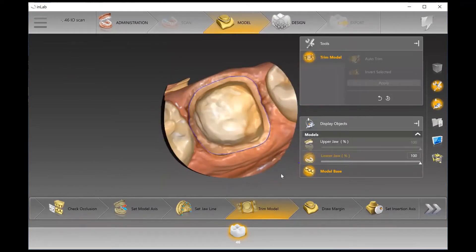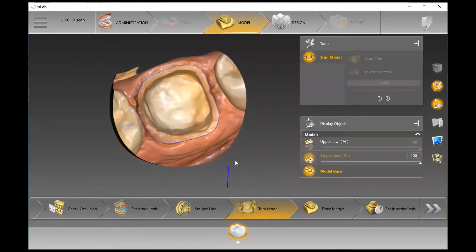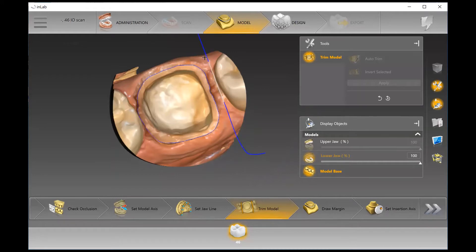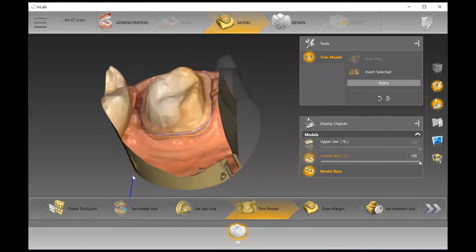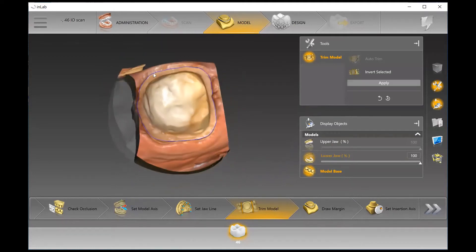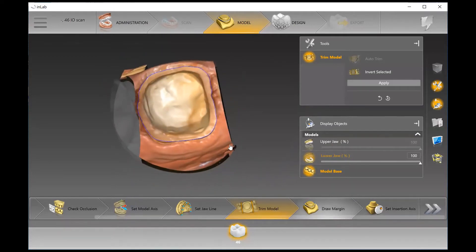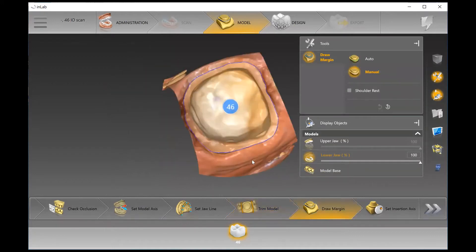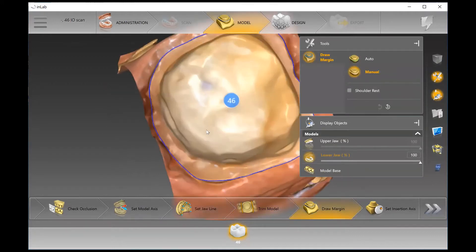The Trim Model step is optional. What the system essentially does is it auto-trims to almost look like a removable die. If you want to take out the adjacent teeth further to make it easier to visualize the margins — which is the next step — that can come in handy, but it is optional.